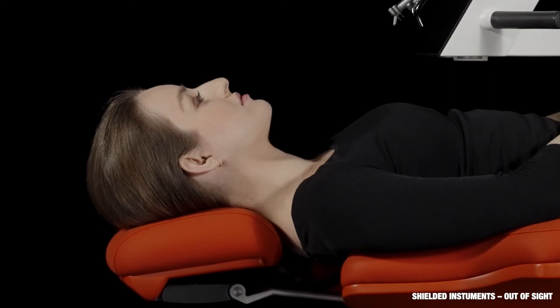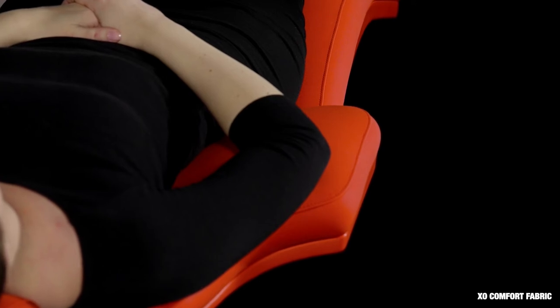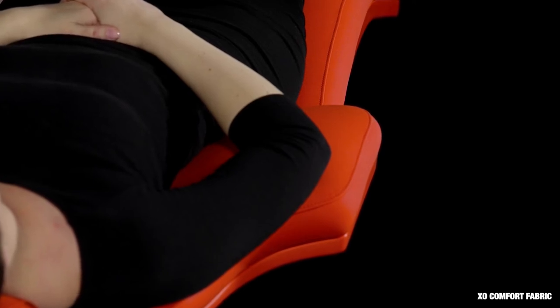The patient neither sees the instruments nor touches them, as they are shielded by the bridge. The EXO patient chair is extremely comfortable and gives optimal support of the patient's neck and arms. The cushions are fitted with EXO comfort fabric that allows the patient's skin to breathe.